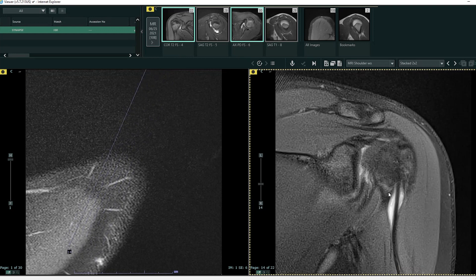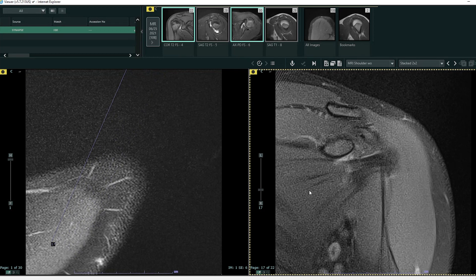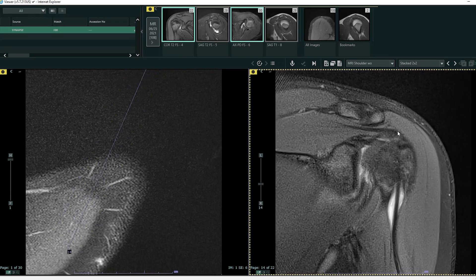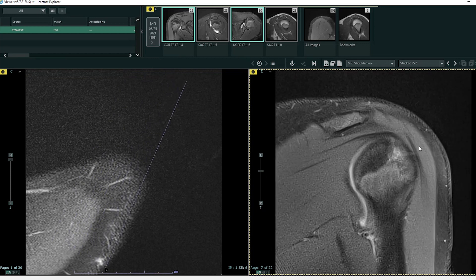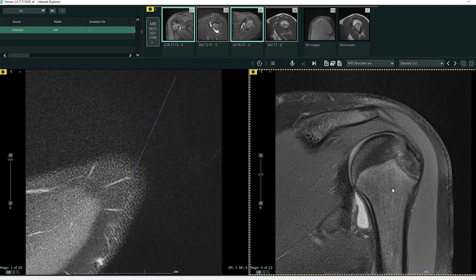There are four rotator cuff tendons heading from anterior to posterior: the subscapularis tendon, the supraspinatus tendon, the infraspinatus tendon, and the teres minor tendon. These all function to help you rotate your humeral head at the glenohumeral joint, or shoulder joint.